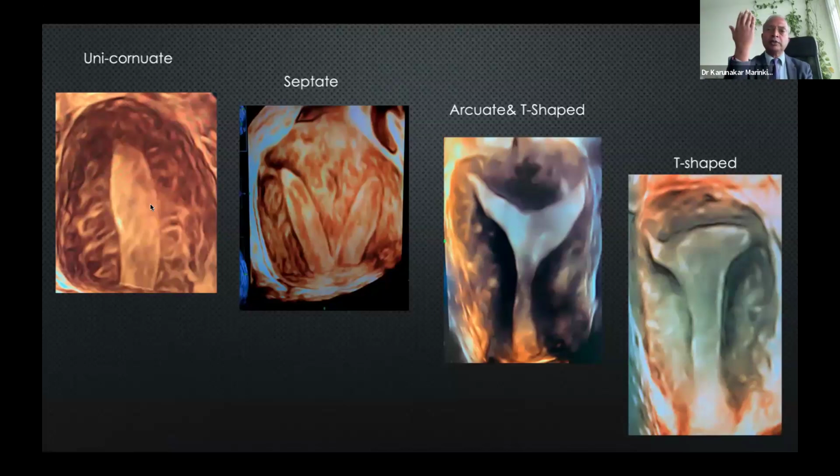You turn any way you want, anterior, posterior view, right lateral, left lateral view. The endometrial chamber looks like a finger, eye shape. That is unicornuate uterus. You can see the septate, complete septum, and you can see adenomyosis distorting in a funny way. You don't need to give names to anything. You can say unspecified shape. That's what I'm trying to say.